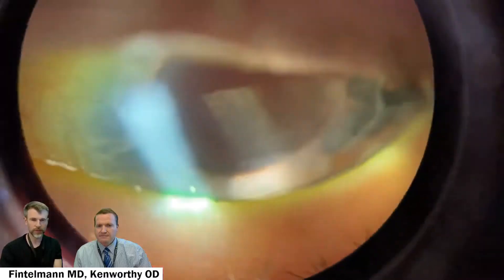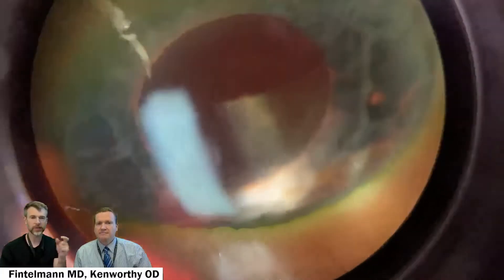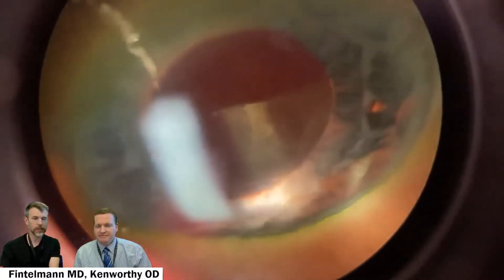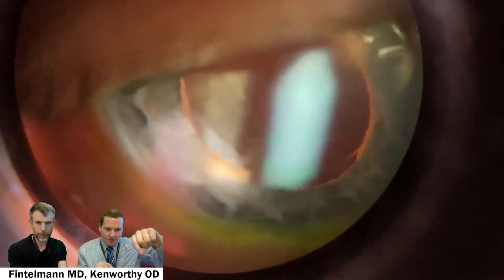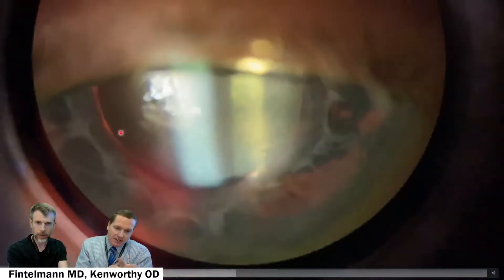Looking at this transillumination defect, it is much less obviously centered over the haptic because in a normal state, the iris is smaller and the iris defect will be more central and match better with the haptic. One useful technique with the slit lamp is having the patient look down or to the side — that way, with a dilated pupil, you can actually see the edge of the lens and its position in relation to the actual capsule itself.